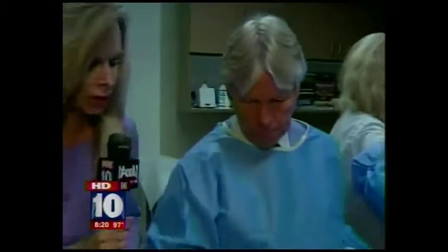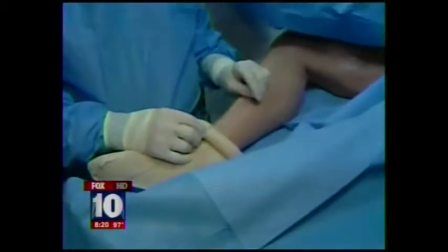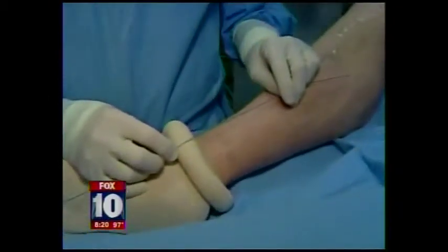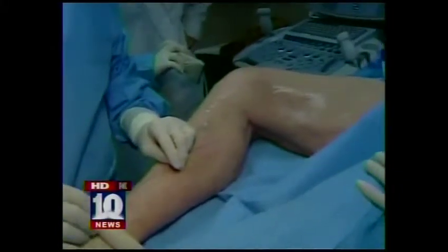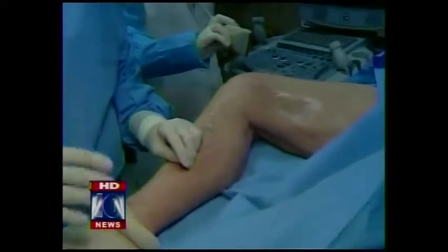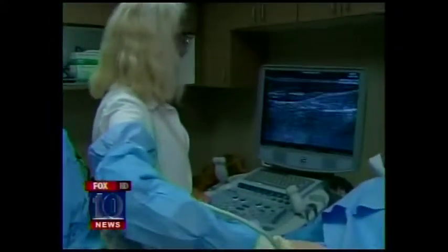It's a much less invasive method of treating veins, rather than the old standard stripping procedure, which was pretty painful with difficult post-operative recovery. Basically, we put this fiber into the vein and then surround the vein with local anesthesia, then turn the machine on and it heats up the vein to destroy it, so that the patient's own body just removes the vein.